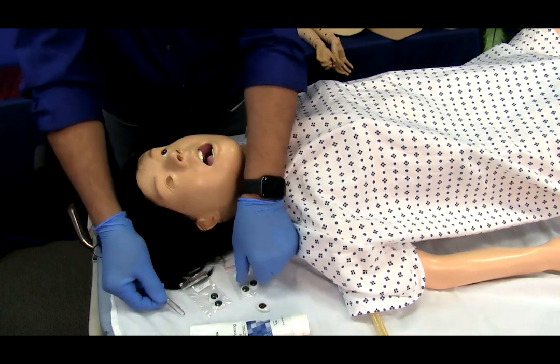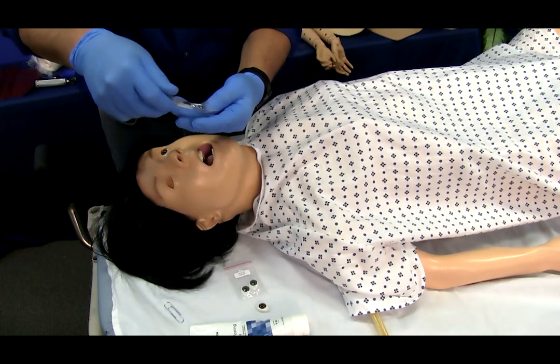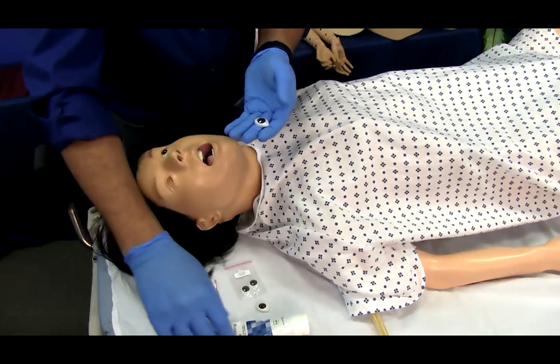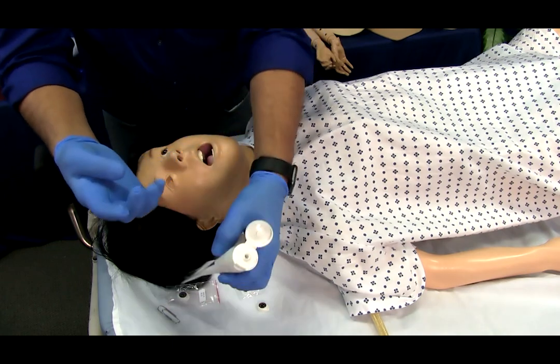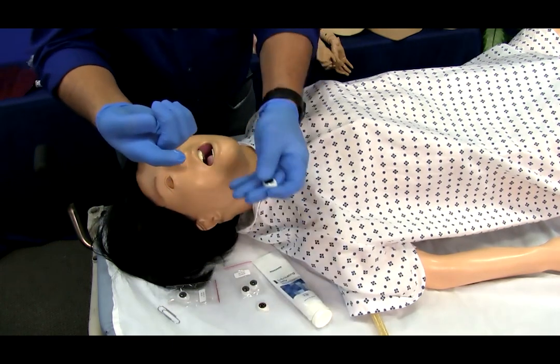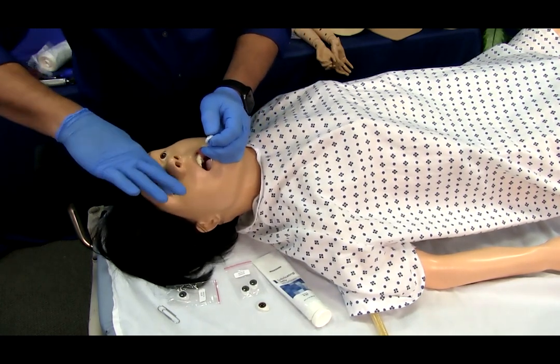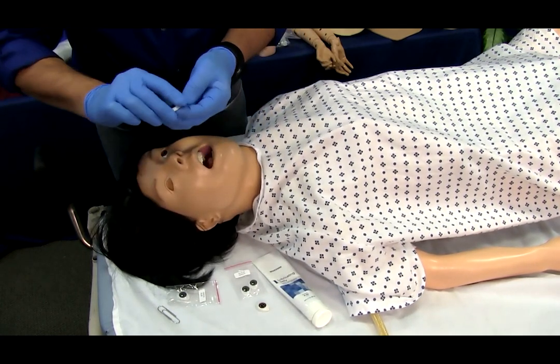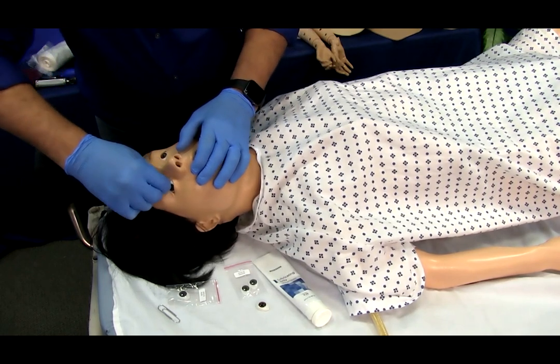Add a small amount of the provided lubricant and pad your finger with the lubricant. Using the lubricated finger, apply the lubricant to the eye socket. Push the new eye under the lowered lid and fit the eye into the socket.